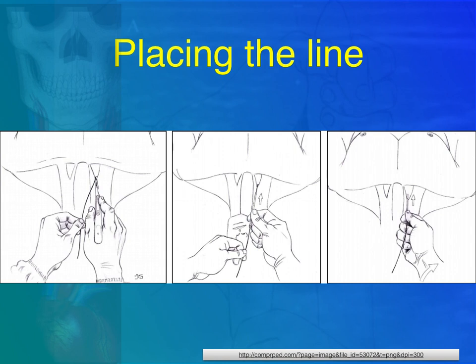through the skin, only to pass the dilator. The dilator can then be passed over the wire to dilate the skin only. The dilator is not intended to dilate the vessel. Very important, do not pass the whole dilator. The dilator again is for the skin and not the vessel.